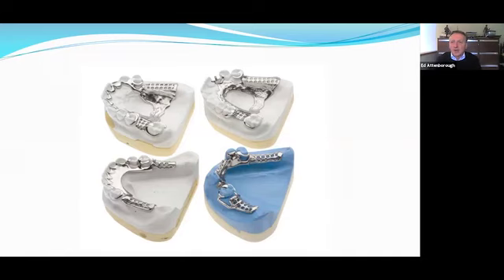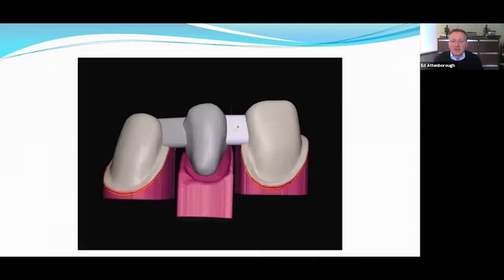So I think we can already begin to see that some of the natural steps and boundaries in the workflow from the classic workflow transfer across to the digital workflow about where it makes most sense to be doing things. Again, here, a second example, designing a simple 3-unit bridge.